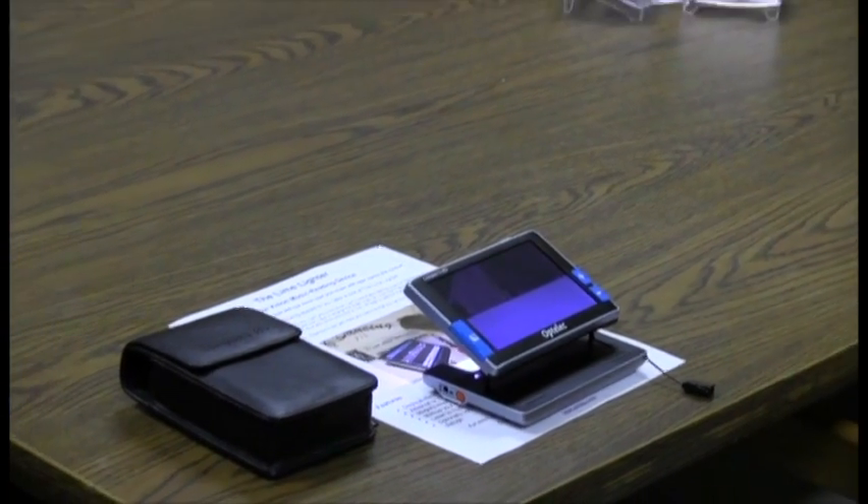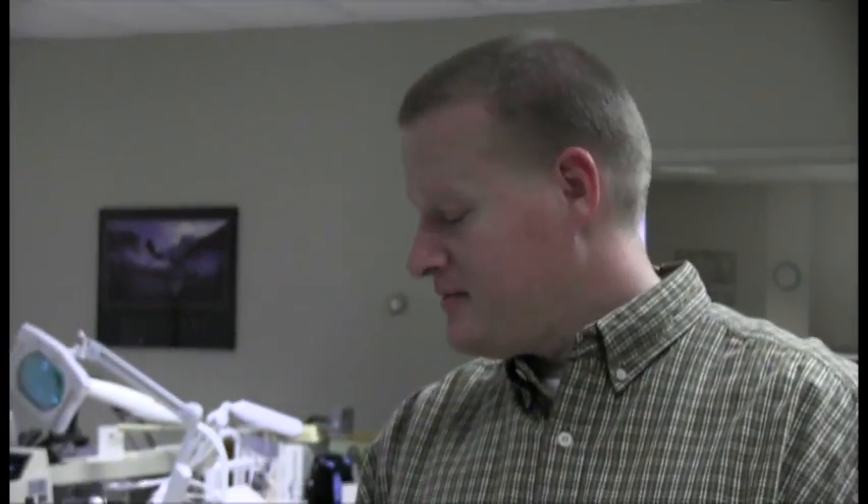So that's the Compact 5 HD handheld video magnifier by Optelec. You'll notice that not only does Brian have a cool magnifier there, he also is wearing the same shirt that I am. So that's your tech tip for this week. I'm Wade Wingler with the INDATA Project at Easter Seals Crossroads in Indiana.